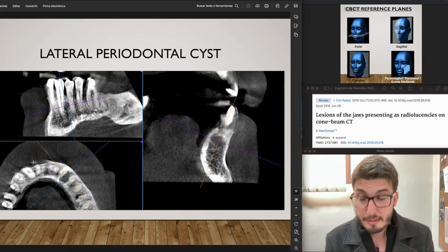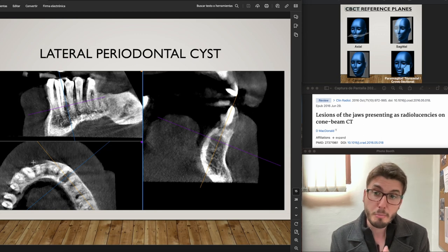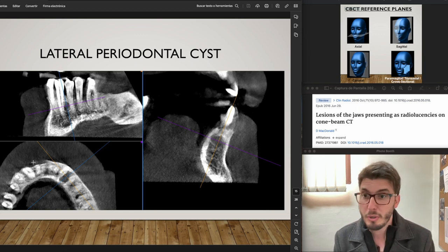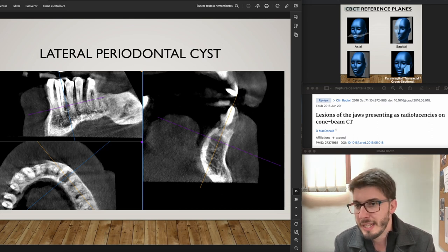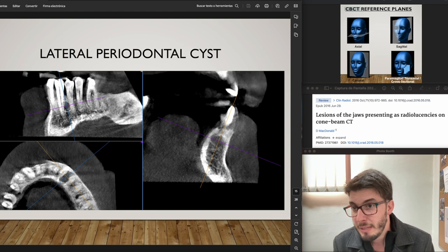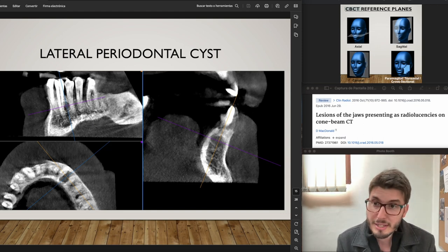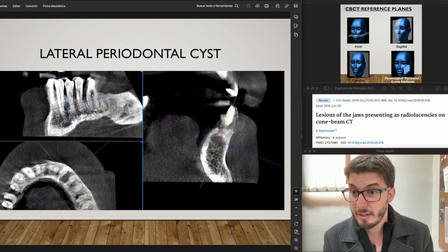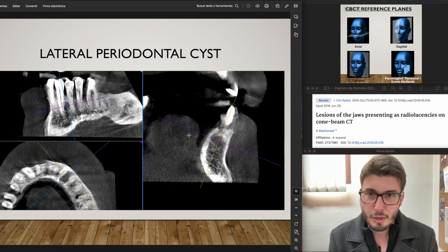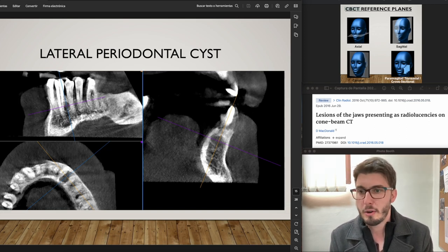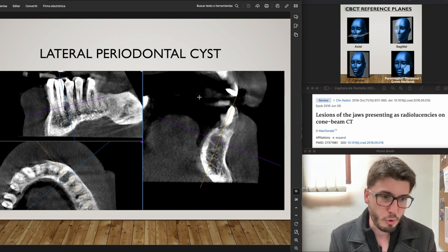Lateral periodontal cysts usually happen in the mandible between the canine and first premolar, or between first and second premolars, in the middle third or beginning of the apical third of the root. Again, well-limited, symmetric, with corticated borders, homogeneous, round — those are the characteristics of a lateral periodontal cyst. Take a look at the level of the alveolar bone crest as well.